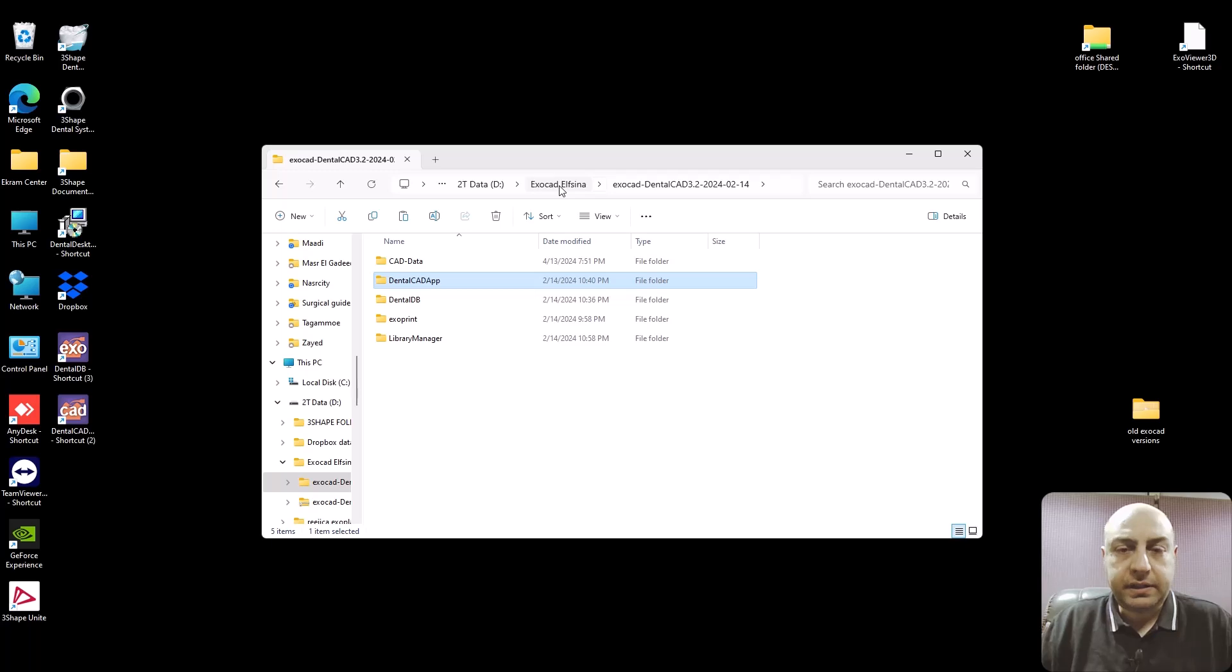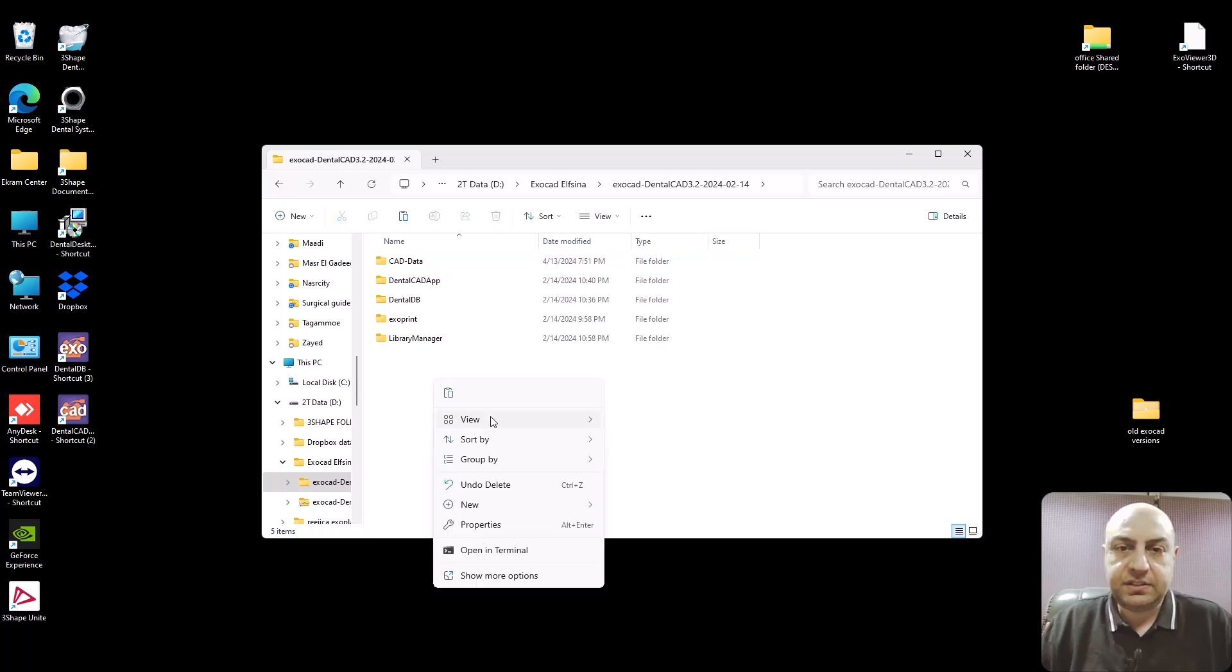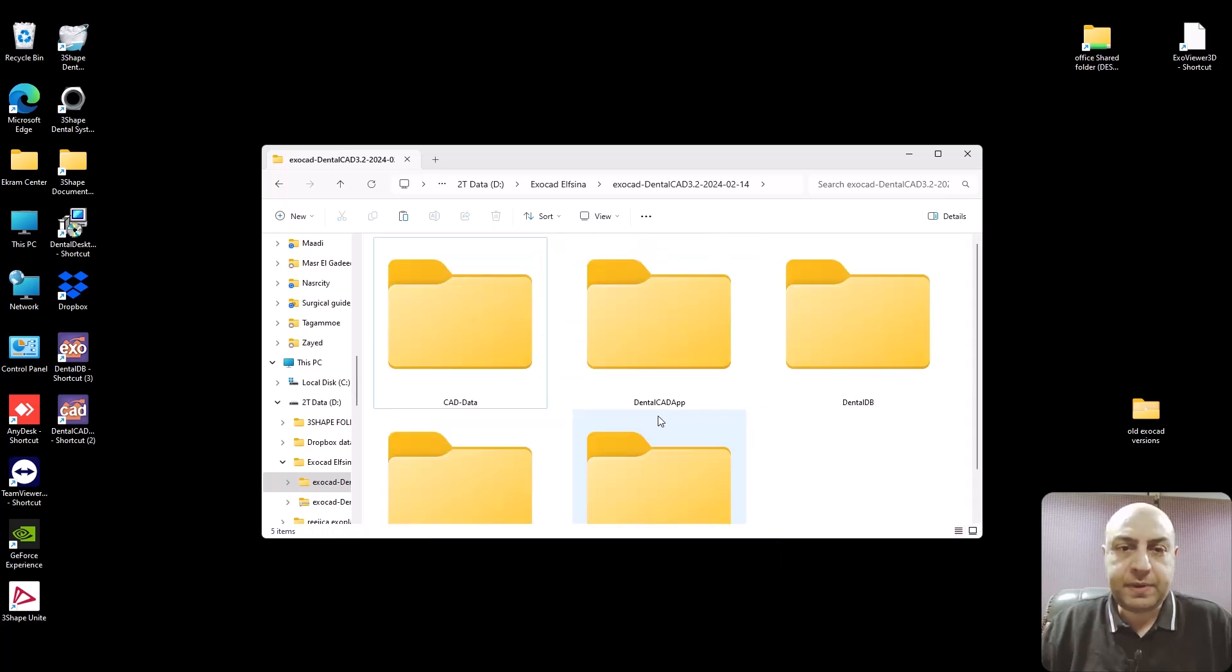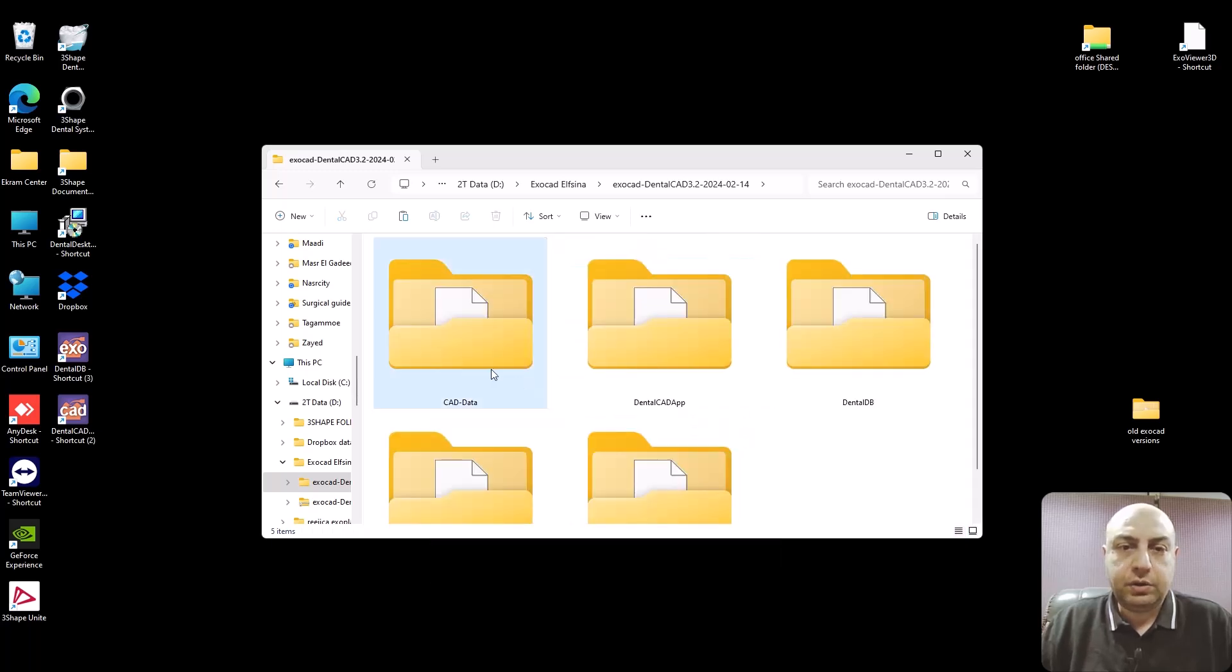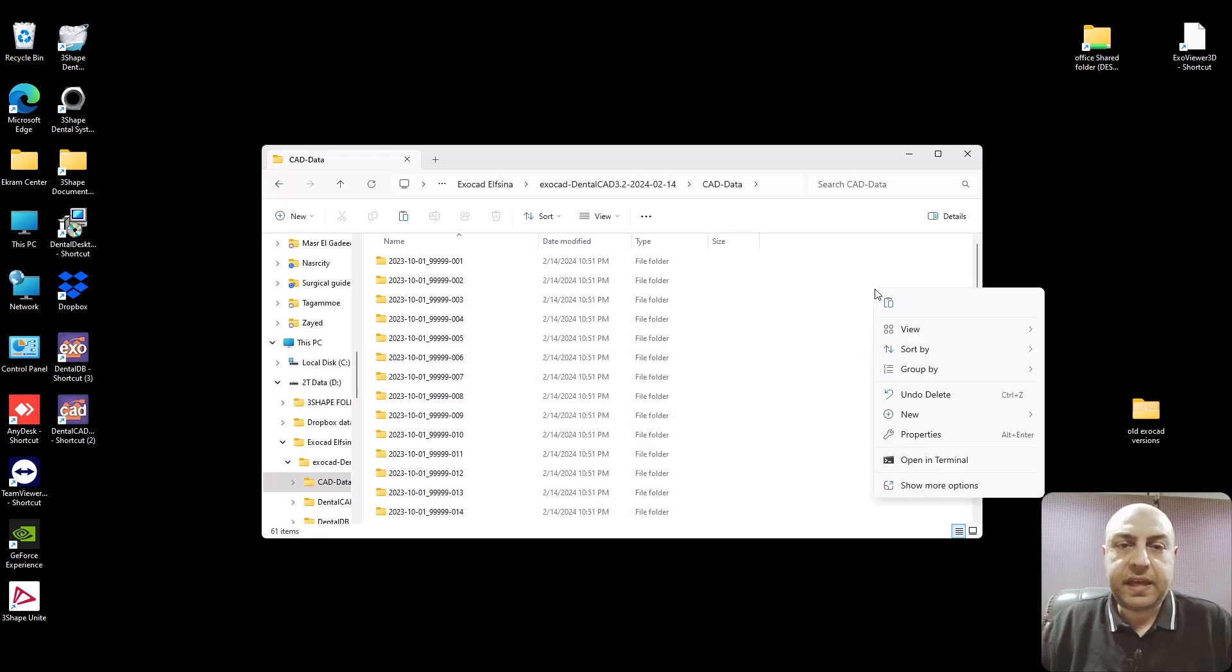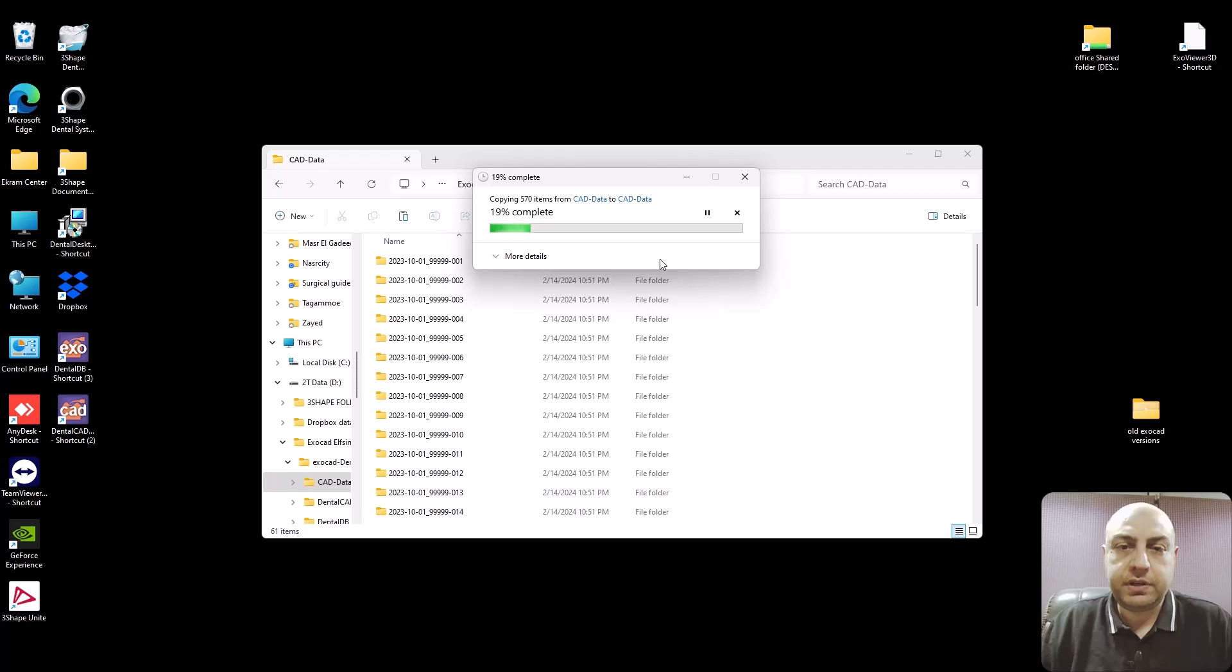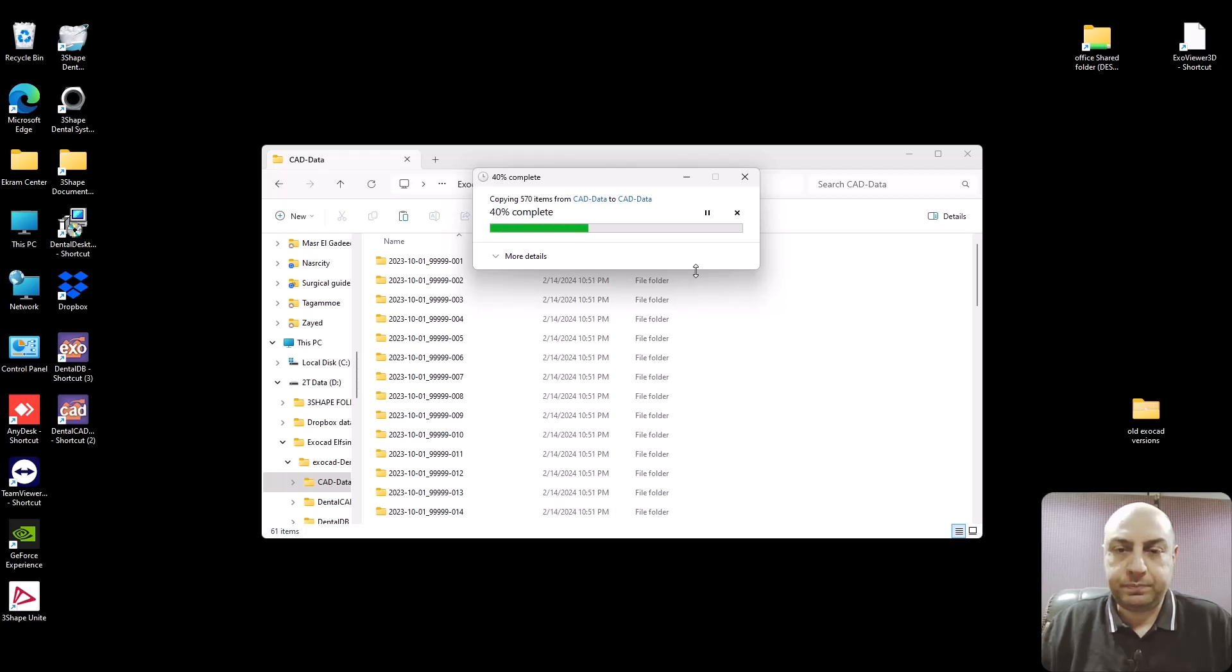Right click and open file location or if you know where the database is, just go to the database. You can just select the cad data and open, I'll show you in a bigger icon and paste your project folder.